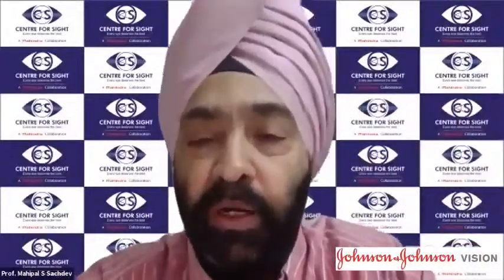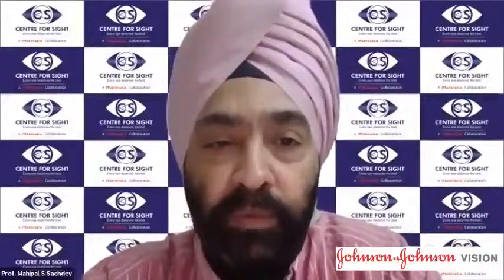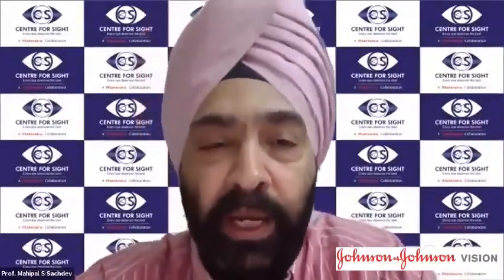I agree completely. I love the laser where it can actually access the lens, but in severe cases like what I've shown you, very often it's not possible. I'll agree with you. In severe cases, obviously it would not be possible, because obviously the planes would be very different between the top part and the bottom part. That I agree 100%, but majority of the times we get partial subluxations or subluxations that can be handled, but again, a person needs to be very deft at doing these things.